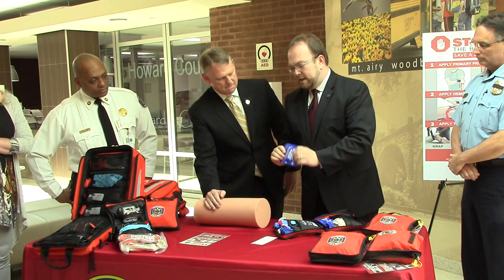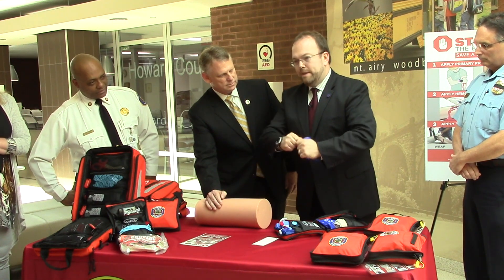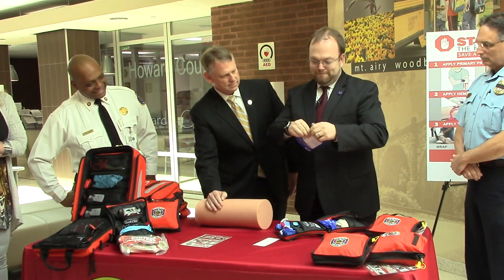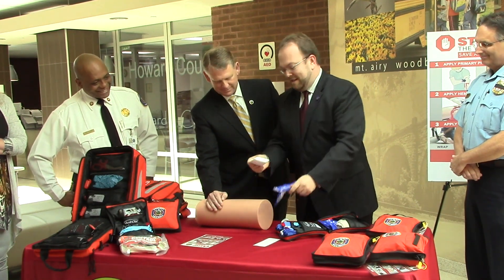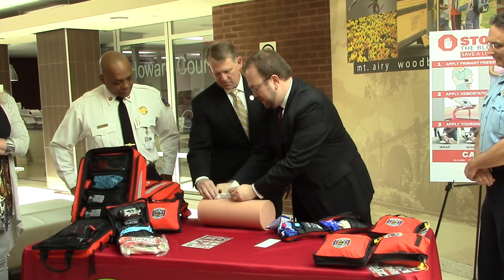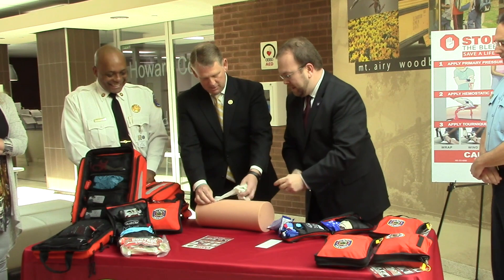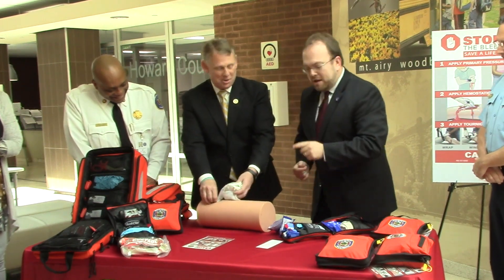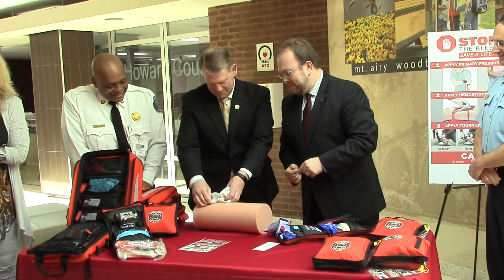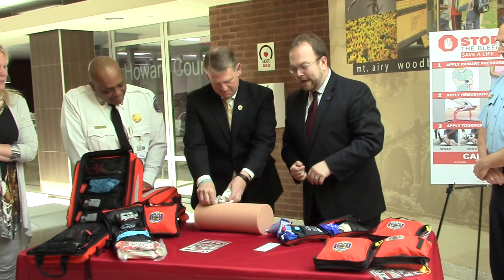We have some gauze here. This gauze has a hemostatic property to it that will help make a clot form faster. We're going to open that gauze up, and now what we're going to do is take that gauze and start packing it into the wound. We're looking for where the bleeding is coming from and we're packing it in there. Go ahead and pack it on in there — keep going, it can all go. We're going to pack and hold pressure, pack and hold pressure.